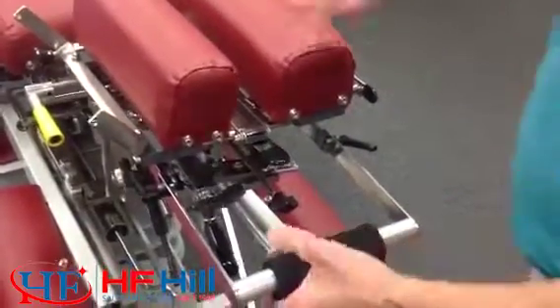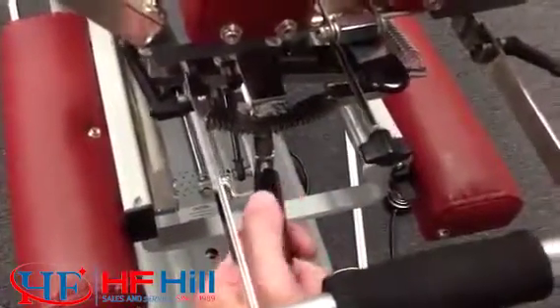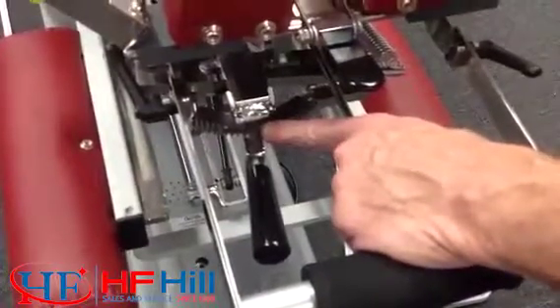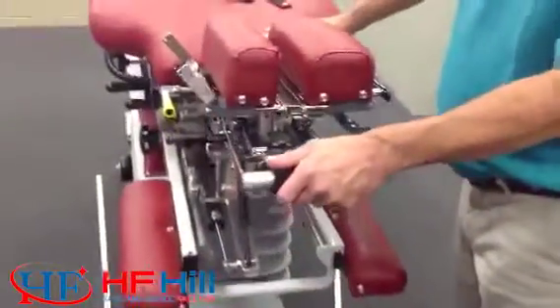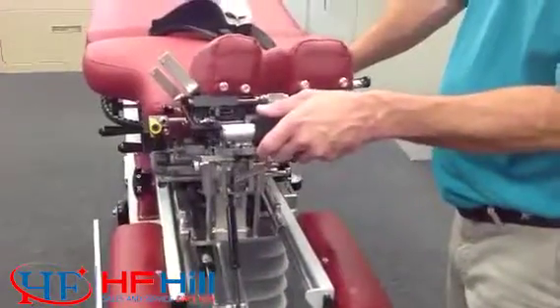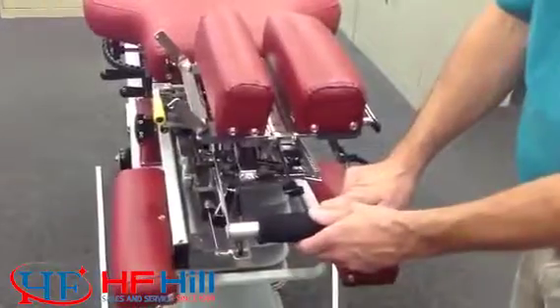This knob over here has an L shape to it. So as I pull out and turn, there's our L slot right there. I pull out and turn, I unlock this tooth mechanism. As soon as I do that, I have complete control over the depth of flexion on our total dimension flexion head. I can go into extension, and I can go into flexion. And I can lock it at most any point in there. All right?